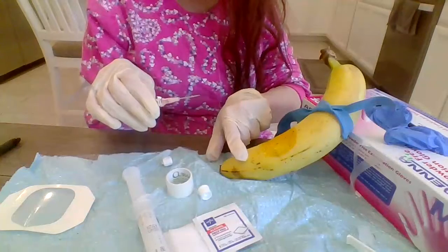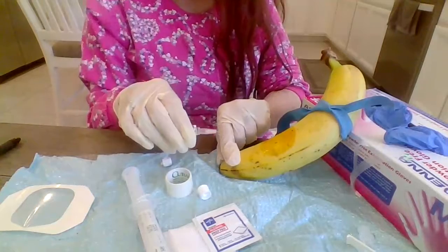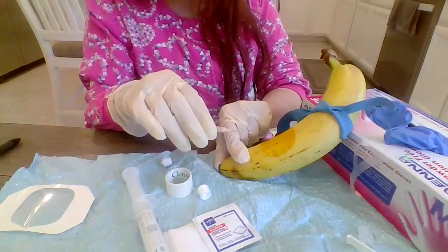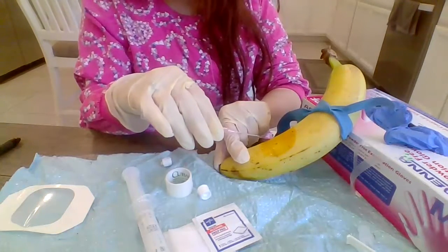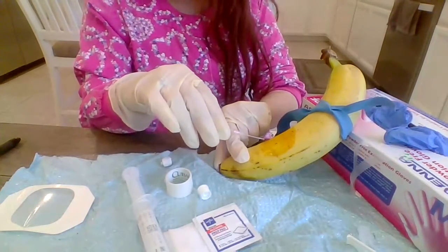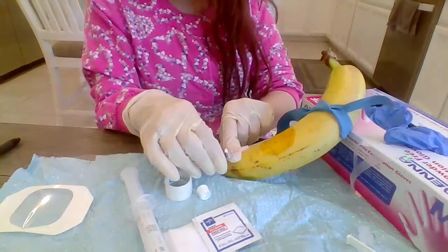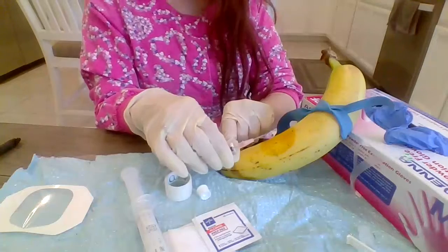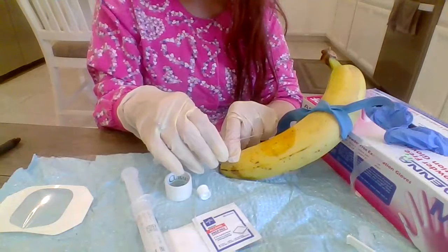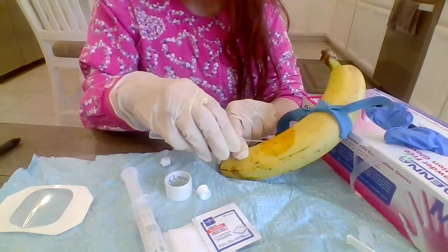So I'm going to pull the skin below the insertion site, so tighten it so I can see the vein better. For this procedure, I'm going to insert it at about a 10 to 15 degree angle, and as soon as I go in, I'm going to pull down and then insert it on a more level angle so that it aligns with the vein better. As soon as I see the blood flushing, I will advance more. So I'm going to go ahead and insert.